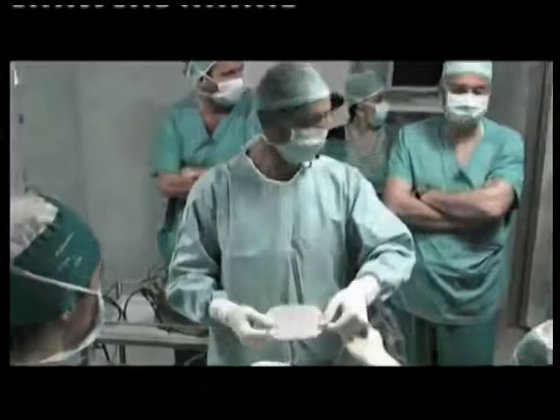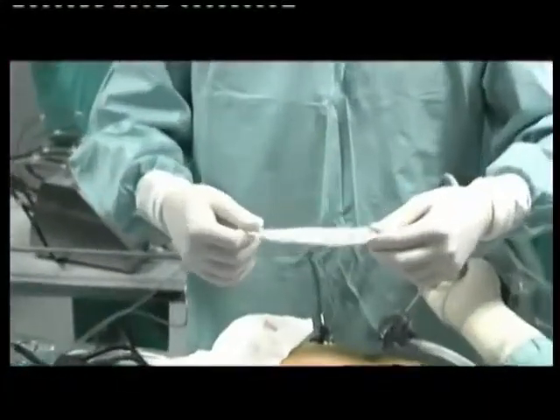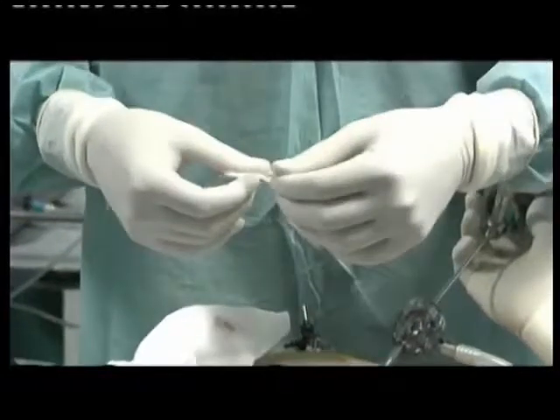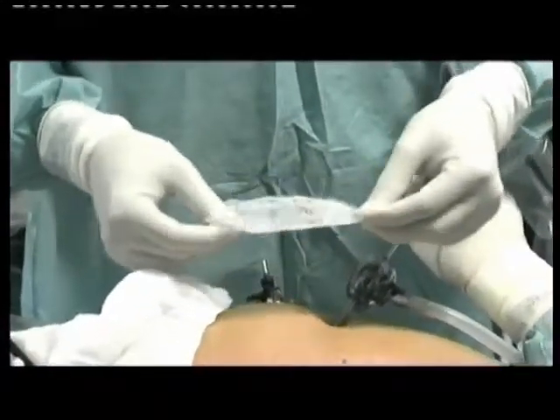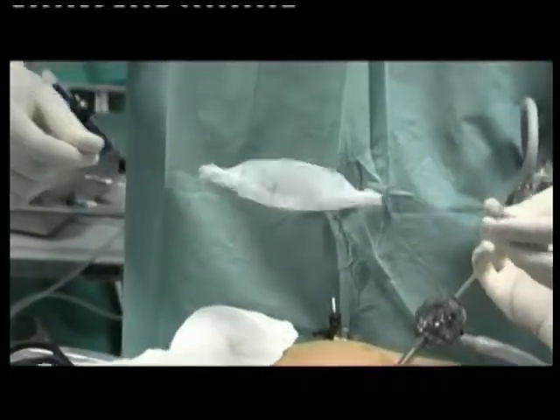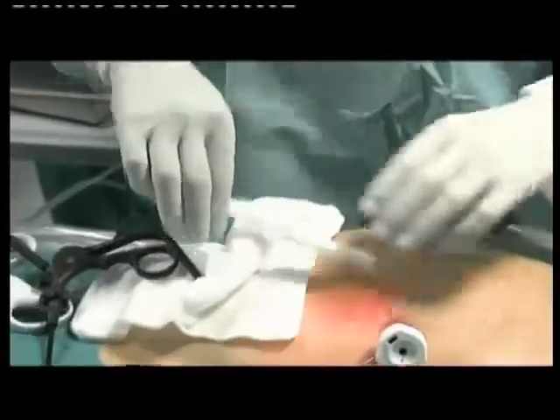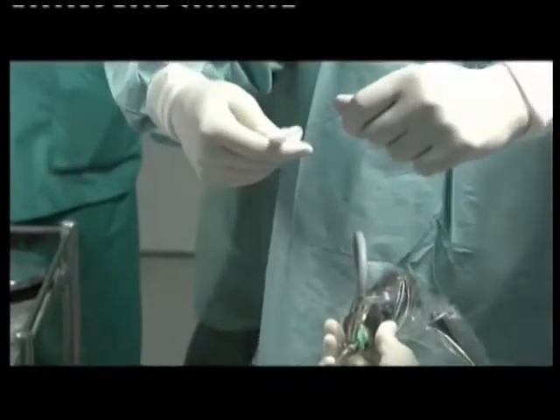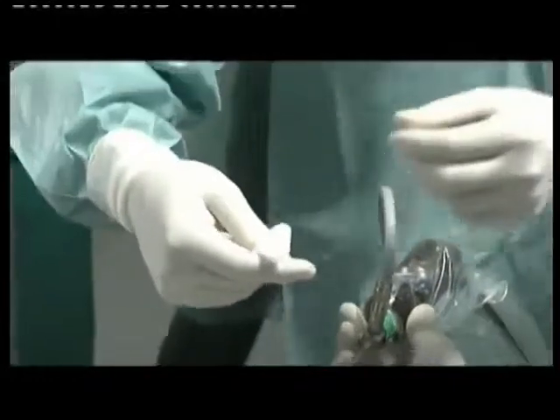Can you see me? Okay, this is a mesh different from what Dr. Duluc used. It's a polyesteric mesh. It is a more soft mesh. It's not prolene, that is tough. And this mesh has this stitch that permits to have this cigarette shape, okay? You see?